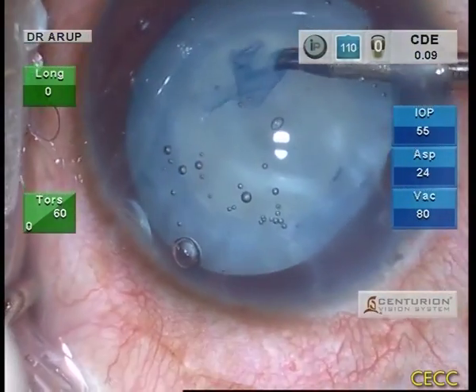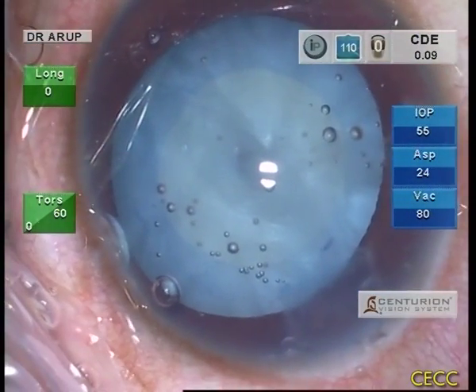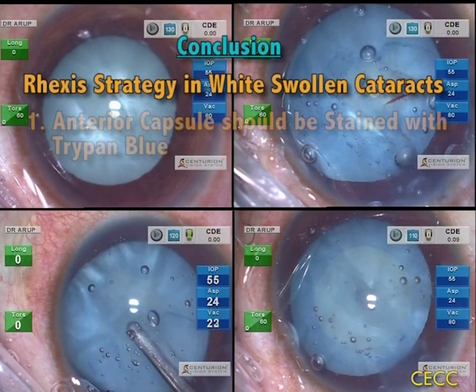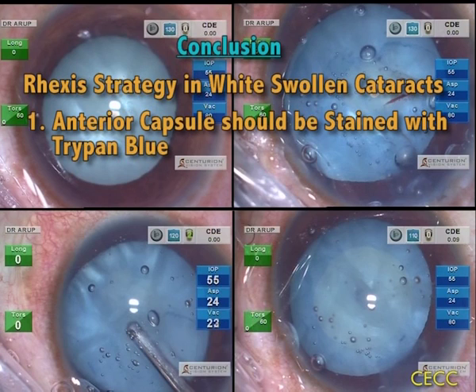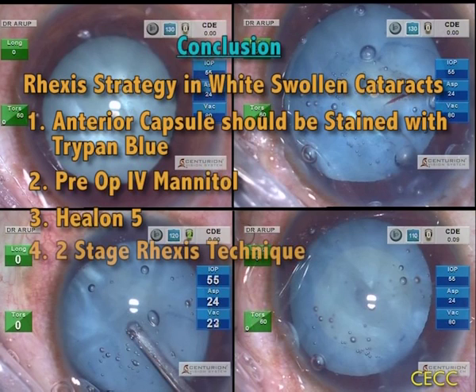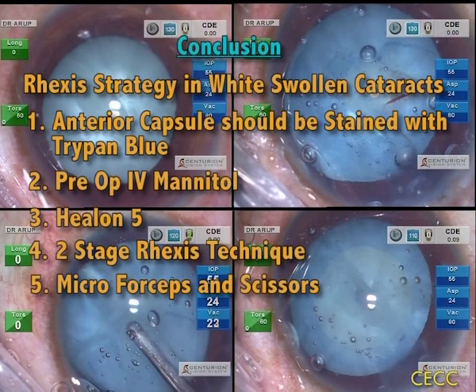Having achieved a two-stage RHEXIS, removal of lens matter can now progress in a safe manner. Though RHEXIS is challenging in white swollen cataracts, a proper strategy makes it quite safe and efficient. Key tips include: staining the anterior capsule with trypan blue; pre-operative IV mannitol especially in patients with shallow anterior chamber; use of Healon V to flatten the anterior capsule; use of a two-stage RHEXIS technique; and micro forceps and scissors, which are very helpful to work through the side port incisions.